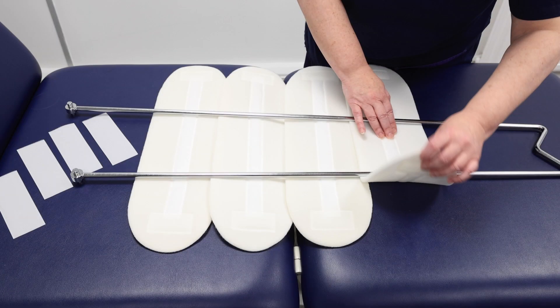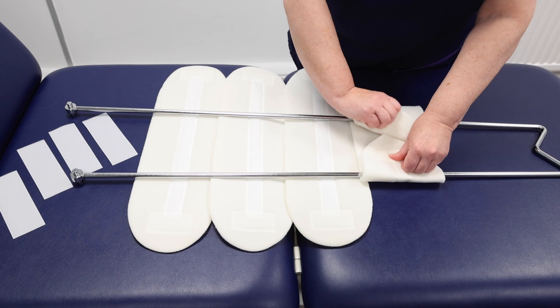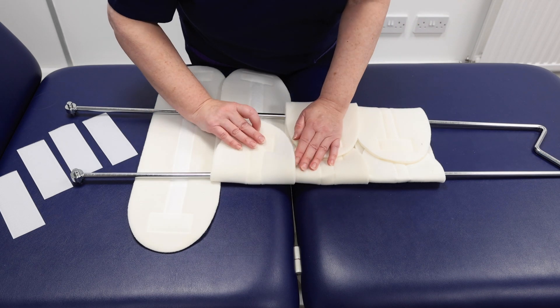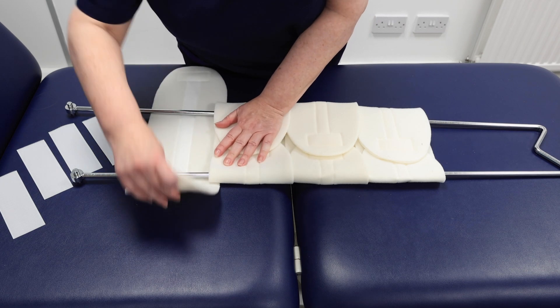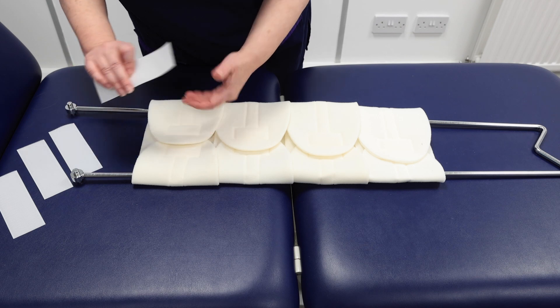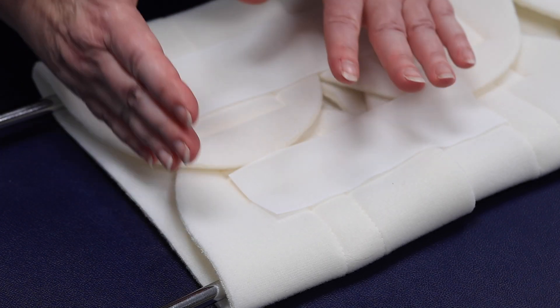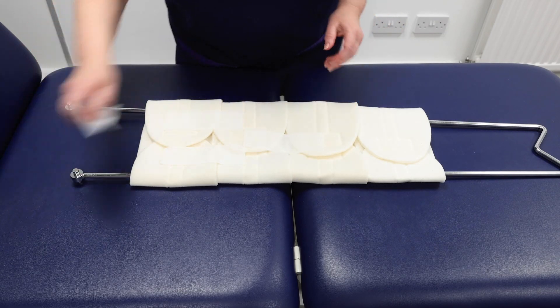Attach the sling, starting from the bottom end, wrapping as you go and leaving some flexibility. Use four hook-and-loop straps: two on the top foam pad at the thigh end for extra support, and one across each remaining pad to keep everything secure.